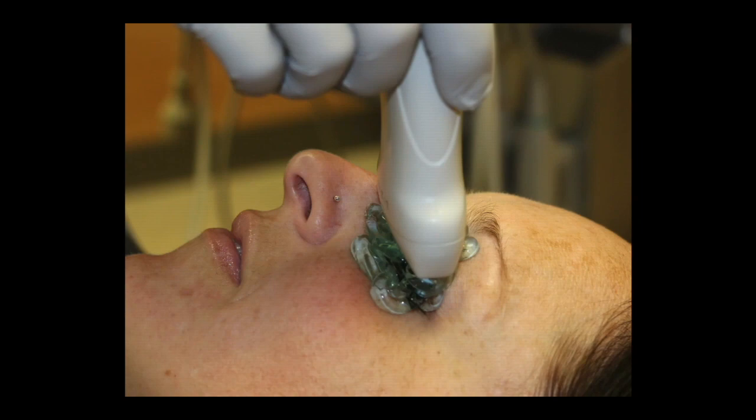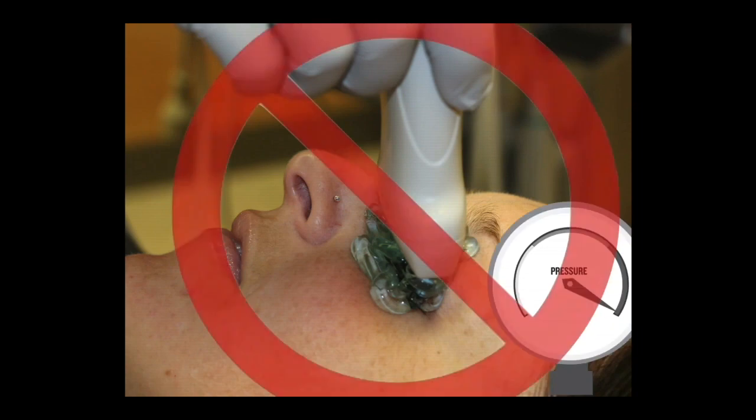You should not be holding the probe like this. Notice how your hand is away from the end of the probe. This is going to make it more difficult to hold your probe still and more likely for you to actually place some pressure on the eye. So try not to hold the tail of the ultrasound probe. Don't do that. You might create too much pressure.